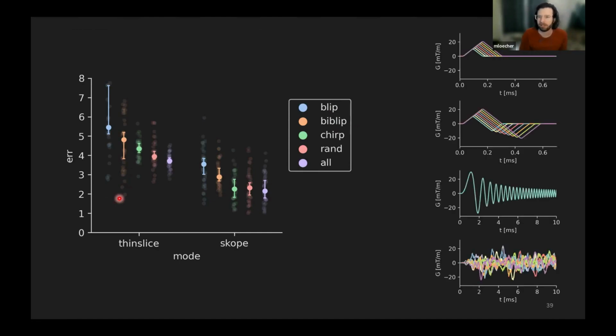So maybe I'll talk about the waveforms first. So the waveforms we tested, there's the standard GIRF is to play a bunch of blips. This is nice. They all have a nice sync profile. And when you do a couple of them, all the lobes of the syncs hit the places you missed in the other blip. And so it gives you a nice frequency characterization. The problem is there's just not that much signal here. They're kind of small. So this is the standard way to do impulse response characterizations, but from an SNR time perspective, it maybe isn't optimal.